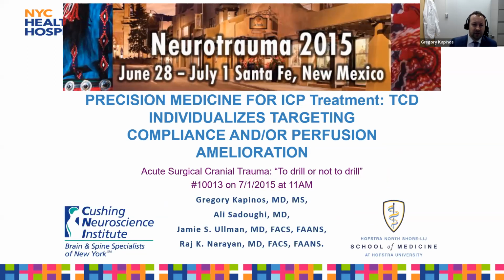So in 2015, we presented that, and I think it was the en vogue term to use precision medicine after, I think, the presidential State of the Union saying precision medicine is the new term that we should use. And it's true, actually, for ICP treatment. I was saying, why are we all blasting mannitol and hypertonic and hyperventilation to our patients, or augmenting the CPP the same way? That does not make sense. We should be way more precise in our treatment of ICP elevation, and TCDs can help you with that.